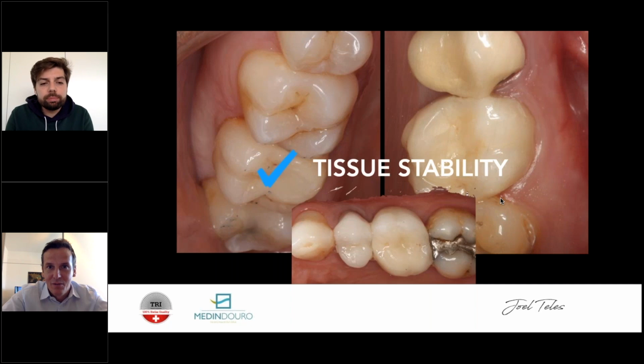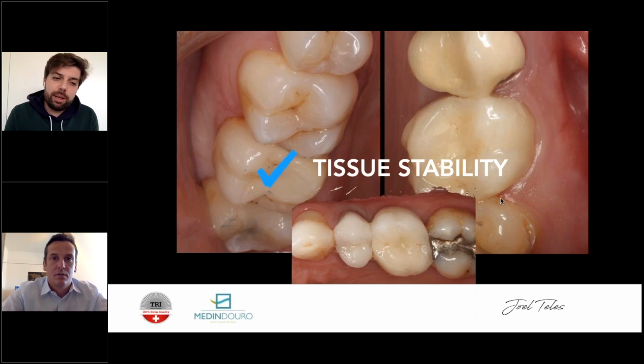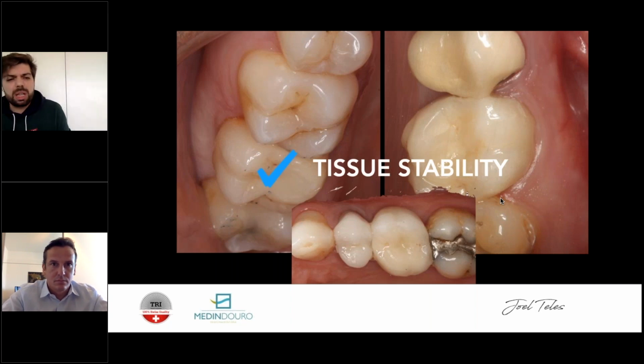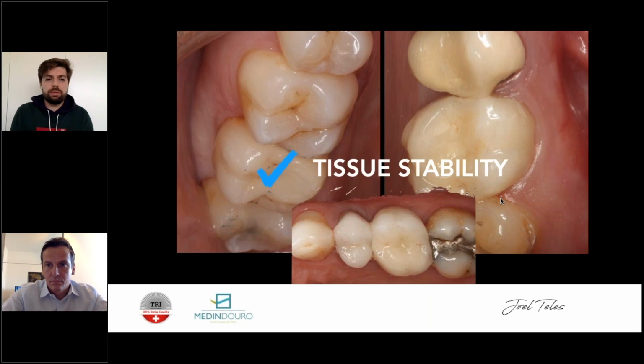And before I pass to you again, there's one question from Tina Sar. How long do you let it heal with the individualized abutment before placing the final crown? It depends on many things. It depends on the amount of implant that is actually touching bone instead of graft material. So if it's touching mostly bone, 3 months. If it's touching more biomaterial than bone, 4 months, 5 months, it depends. Okay, but more than 4.5, almost never. In between 3 and 4.5, more or less.